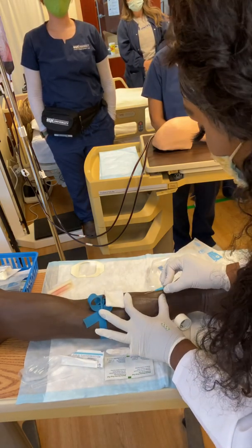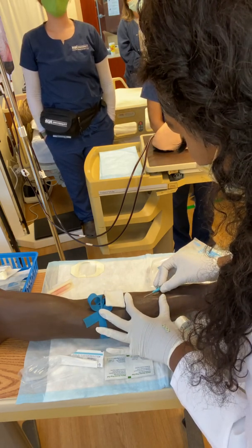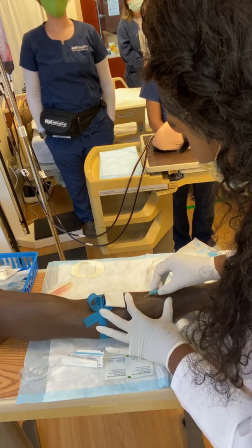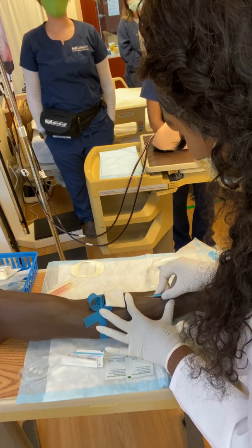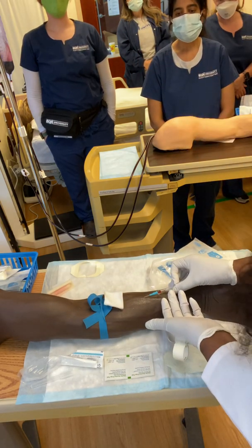All right, so we hold that skin taut and we just advance right in there. This is such a tiny vein, so we'll see how it works. This is a tiny needle, so we'll see how it works. All right, so as we put it in there, you see that blood return, right?